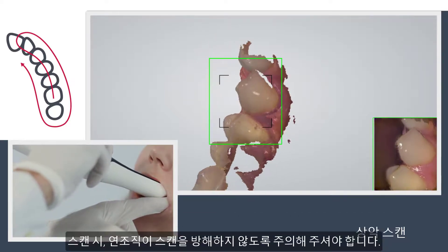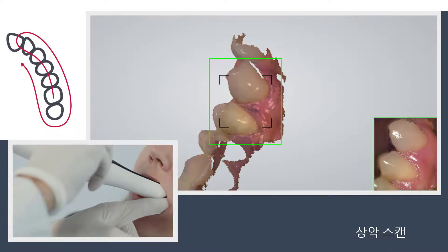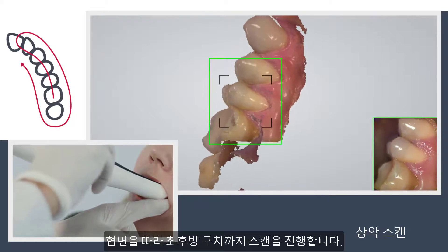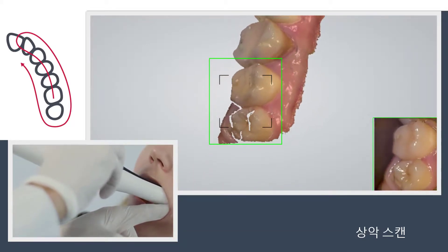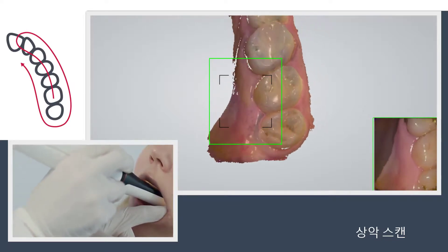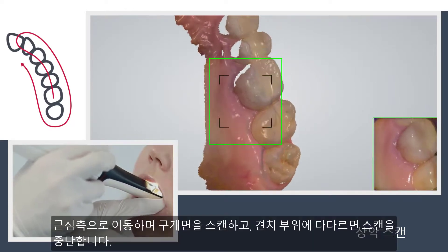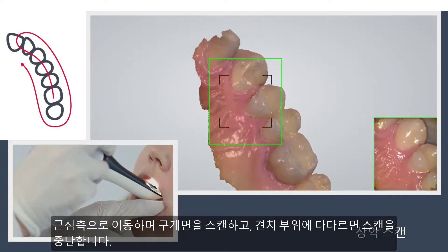Taking care first of the areas where soft tissue may interfere with the scan. Complete the buccal swipe until you reach the last molar. Scan the palatal side moving mesial and stop scanning when the K9 has been scanned.